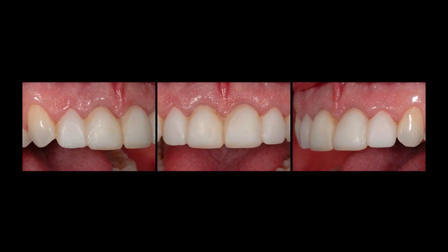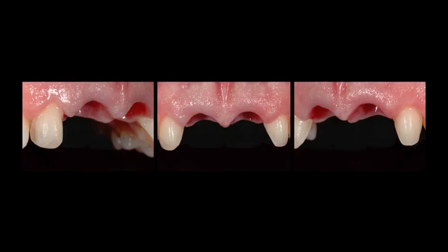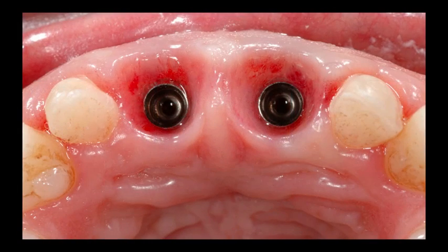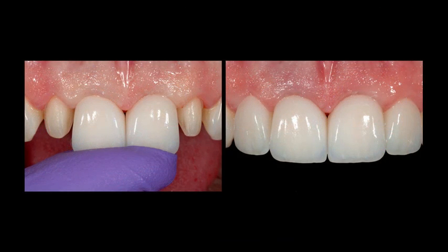And so the patient comes back and he's ready to have the case inserted. And you can see he's neglected to floss a little bit between the two central incisor implants, and I have a little more blunting of the papilla again. So there's a slight blunting. It looks like the tissue is relatively healthy, but I believe that we'll have to take a look at how the contours look relative to the final restorations.